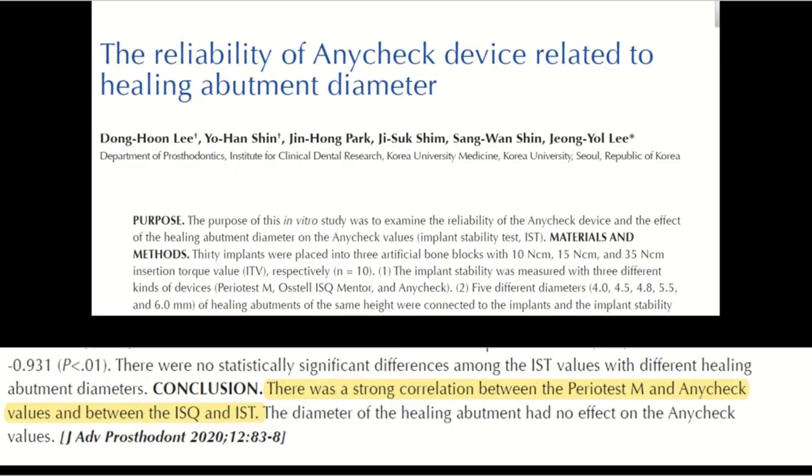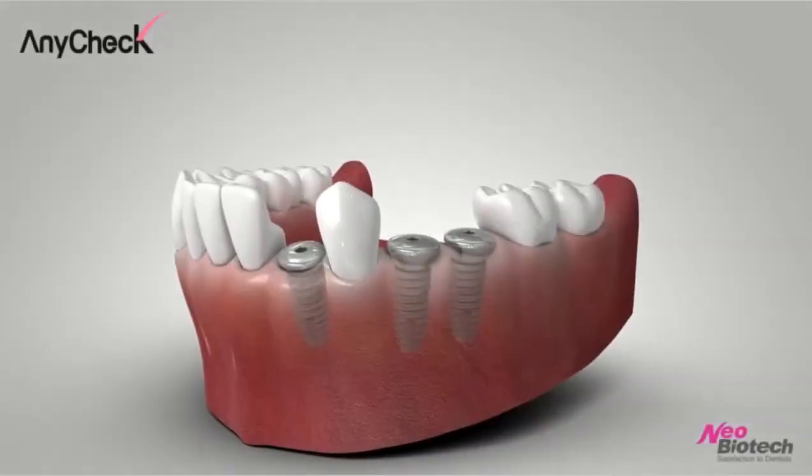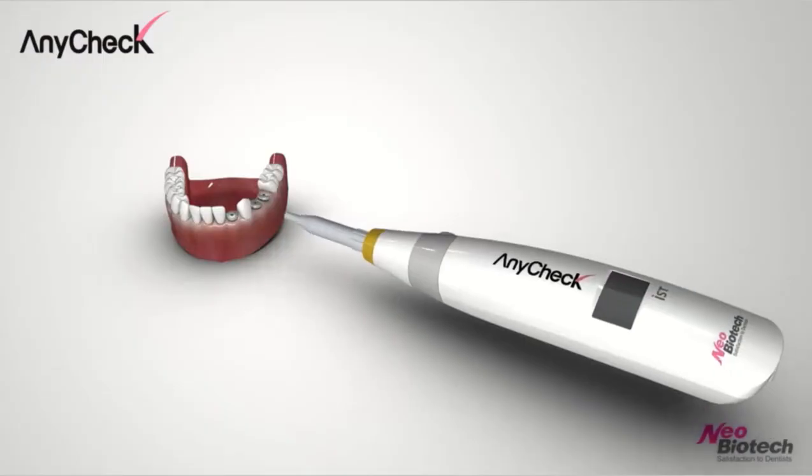Here is the review of the literature showing the reliability of the damping capacity when compared with the Periotest and Osstell device. For me, I use both of them, and they give me nearly the same numbers. Here is how we use Anycheck.